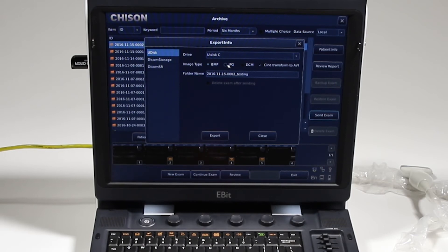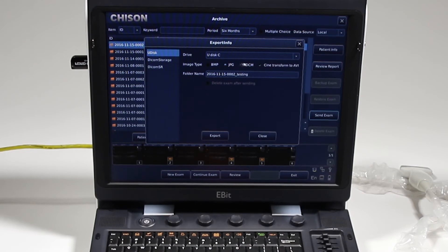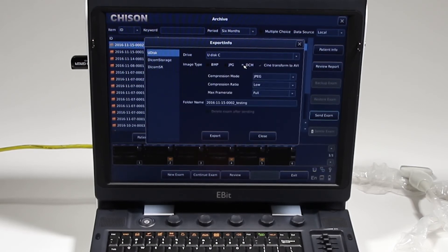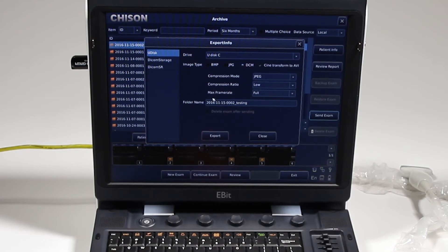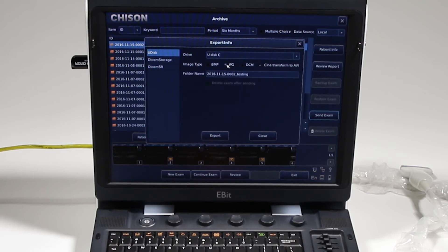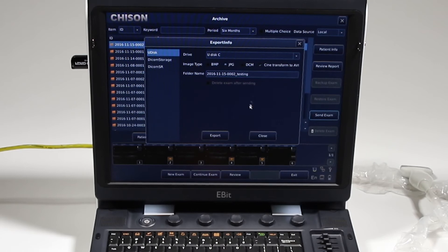I'm going to select JPEG and CineTransform to AVI. These are all various formats for the PC. DCM is your DICOM. You can also choose for it to delete the exam once it's sent, but I'm just going to go ahead for a PC format with AVI and JPEG. I've got the Udisk, and I'm going to click export.